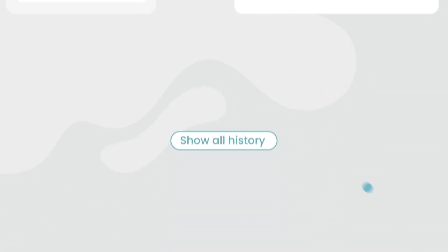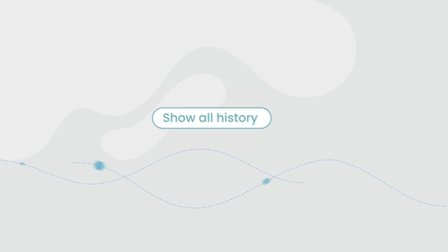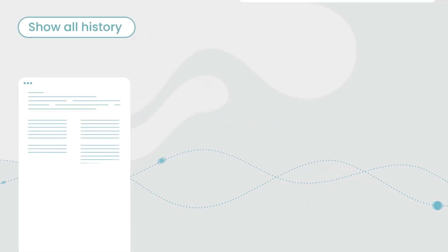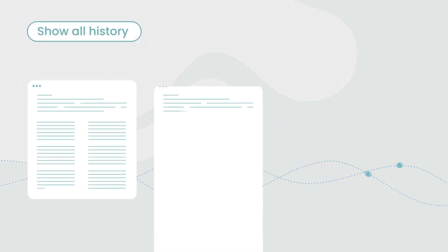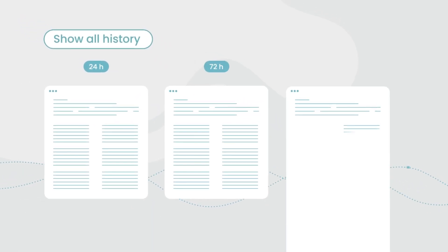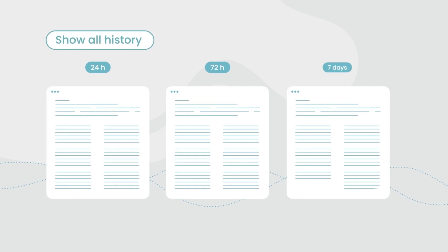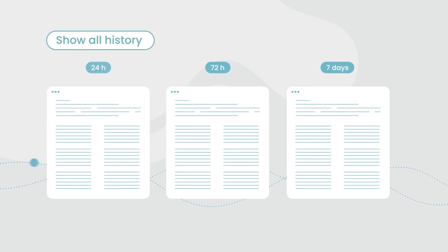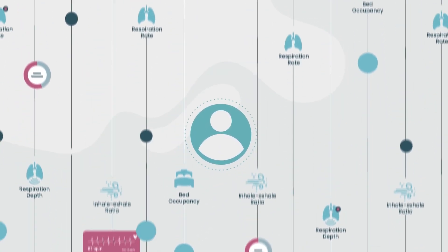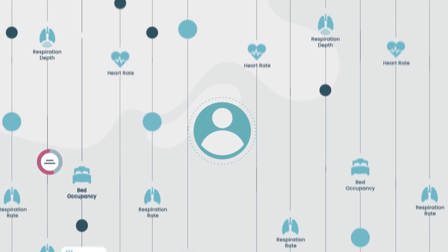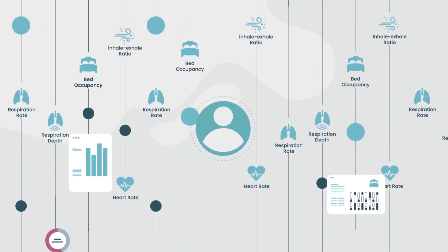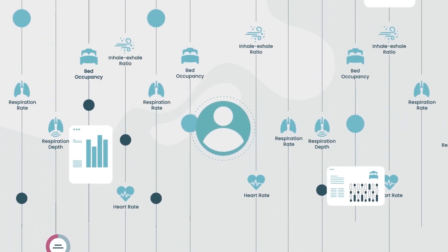The patient dashboard displays patient data in real time as well as historical data over 24 hours, 72 hours or 7 days. Analytics are available to better understand patient condition, such as vital sign baseline, trends and abnormalities.